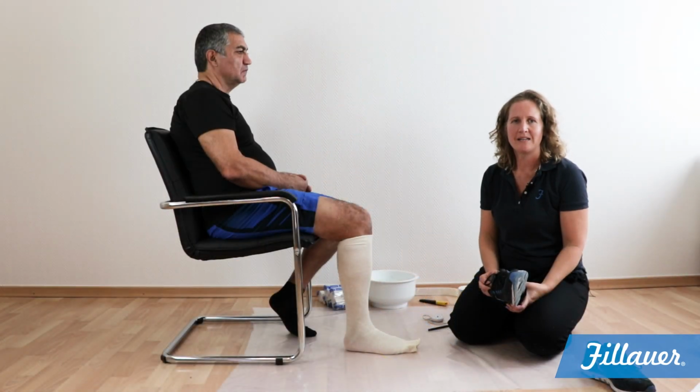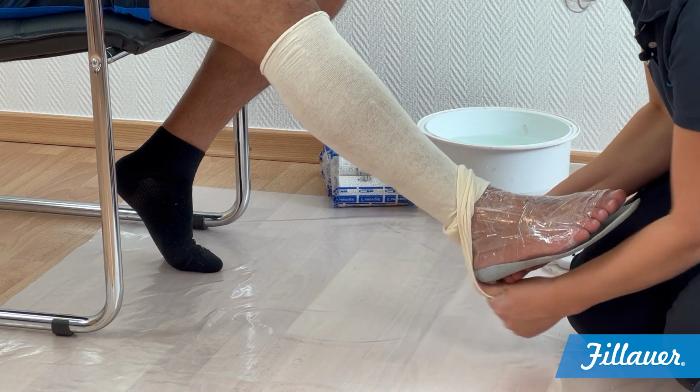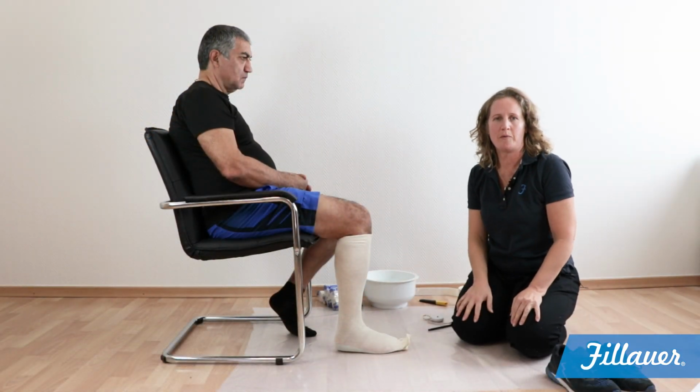If the dynamic walk is going to be used with the insole, you need to cast with the insole on the foot. This should also be marked on the form.